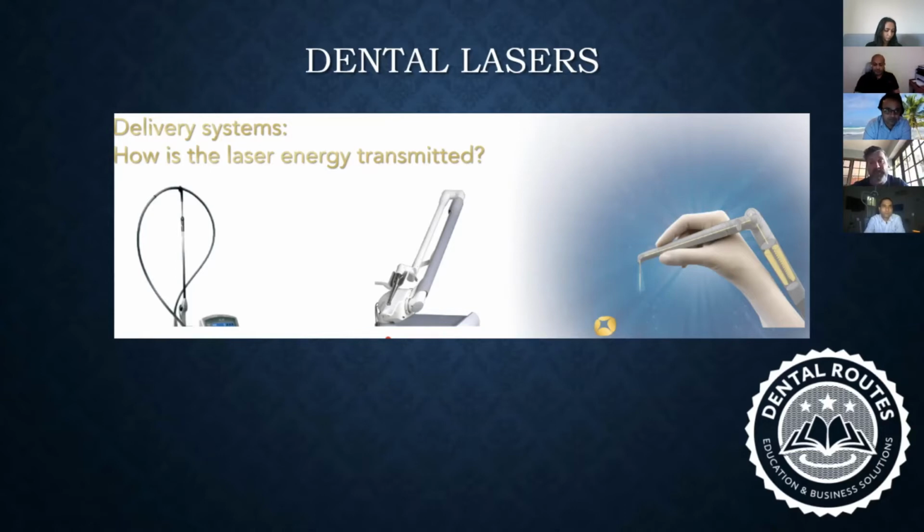Of course, absolutely right. And so the mirrors are also going to be a weak point ultimately? No, because a mirror is the only way you can reflect it. So I don't see a problem with the mirror, because you can get a good quality mirror which can reflect the whole thing 100%. So in terms of reflection, I have no issues. It does a very good job.